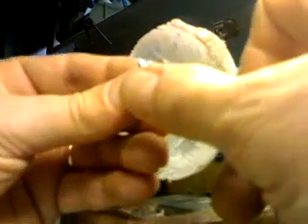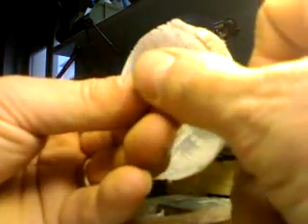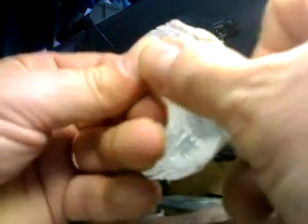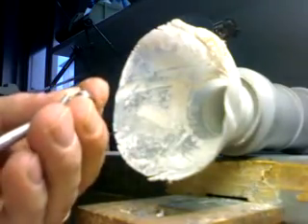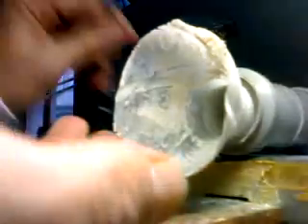Once this coping is ready, it will go through thermal treatment. Thermal treatment is another procedure that belongs to the working phases of ceramic. So we're done with this coping now. Here it is — it fits fine on my die and I'm satisfied with it.